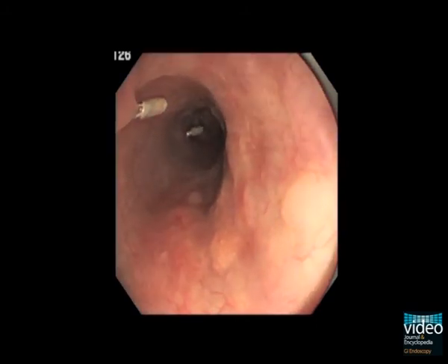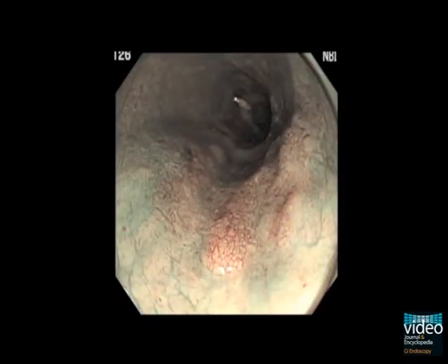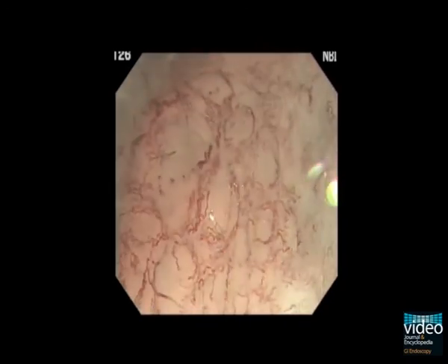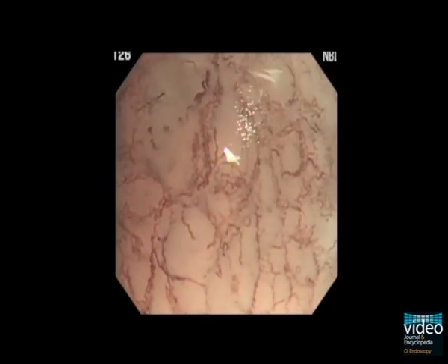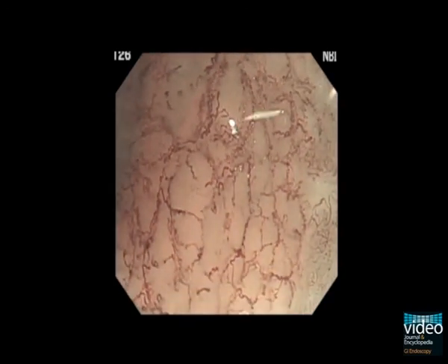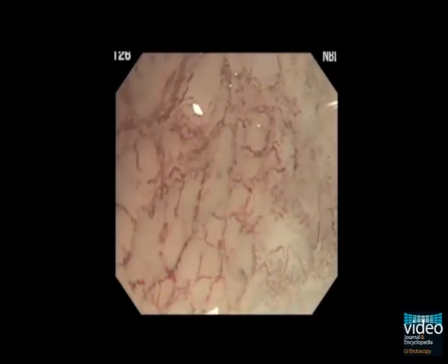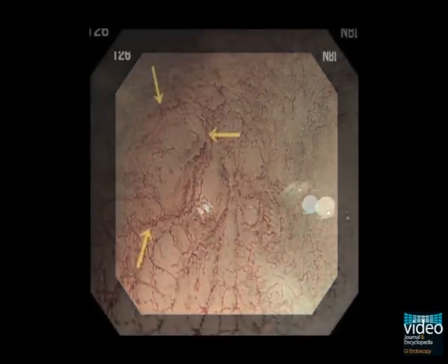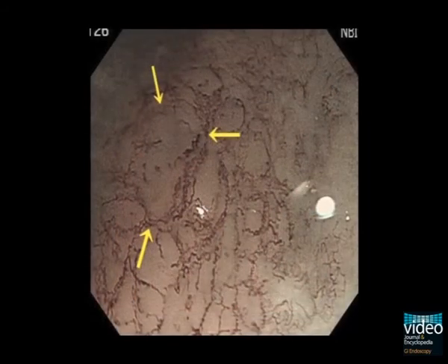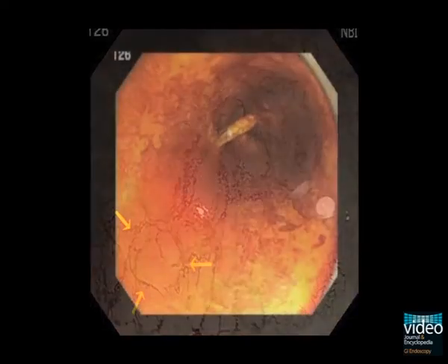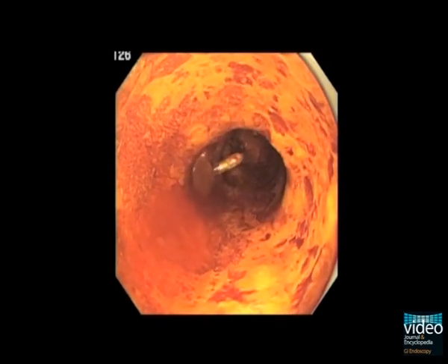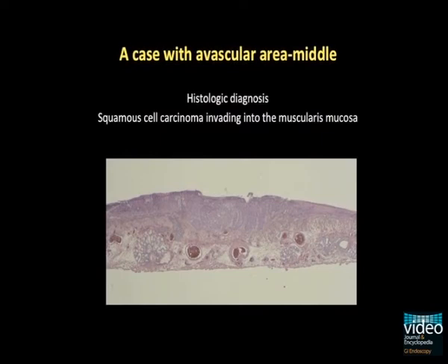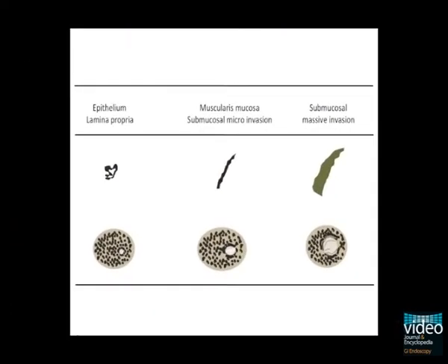This is an esophageal cancer in the mid-esophagus. Marker clips were placed adjacent to the lesion at the previous hospital. The lesion was slightly elevated at the oral end. Magnification of the elevated area shows avascular areas surrounded by non-loop vessels about 1 mm in diameter. Iodine staining shows a cancer extending over two-thirds of the circumference of the esophagus. The histologic diagnosis of the resected specimen was a cancer invading into the muscularis mucosa.